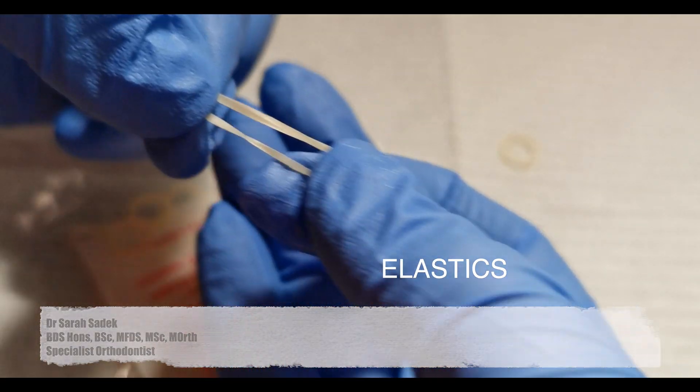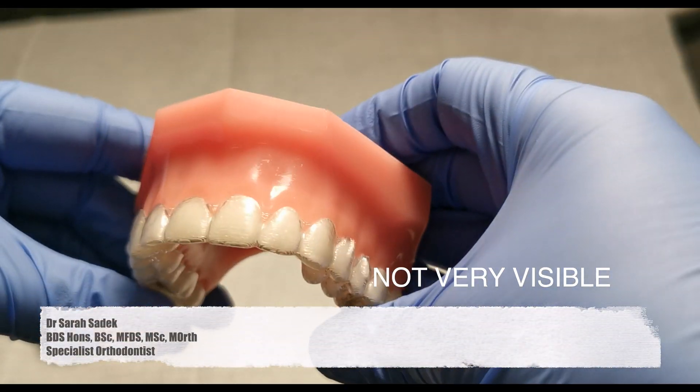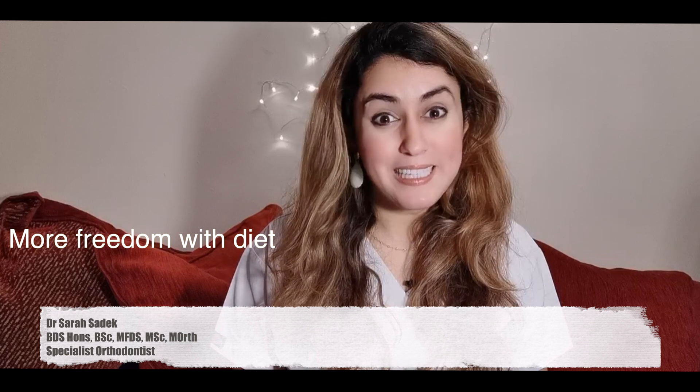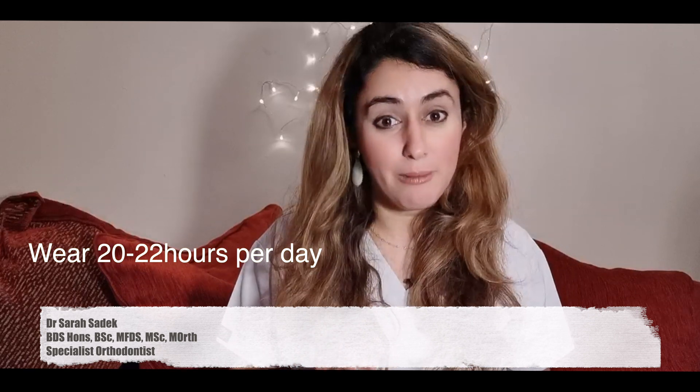Some of the benefits of Invisalign are that it's barely visible, so unless someone's really up close to you, it's unlikely that they're going to be able to see the aligners. It can be argued that you do have some freedom over what you can eat, so you don't need to worry too much about eating hard foods, unlike traditional train track braces. But with Invisalign, you also do need to make sure that you're keeping the aligners in for at least 20 to 22 hours a day for them to be effective.